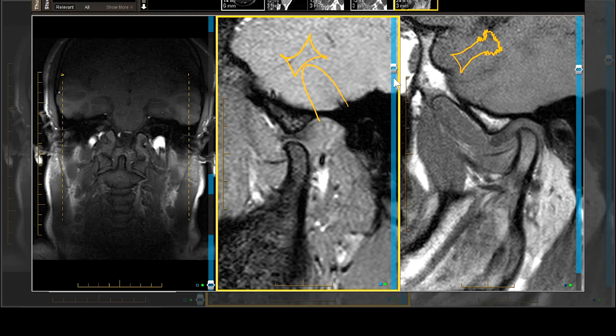This is an example of a swollen posterior portion of the meniscus, anterior displacement, a swollen retromeniscal pad, and capture with mouth opening in a 22-year-old man. The contralateral side will be shown in a separate vignette.